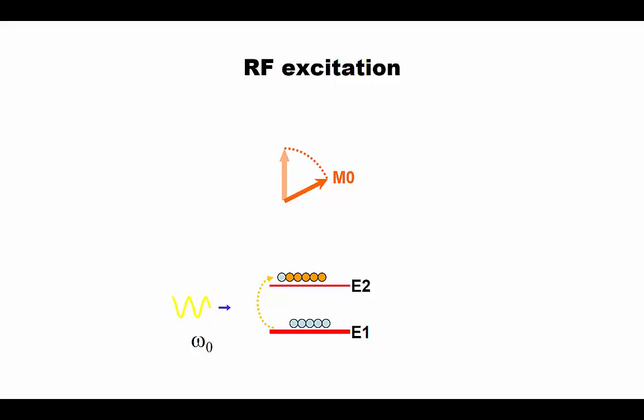When activation is stopped, each component will come back to the original position through the so-called relaxation process. During this relaxation process, it is possible to isolate the Z component from the XY component. The Z component change we call T1 relaxation, and the XY component change is T2 relaxation. It may be easier to see a movie clip to understand this excitation and relaxation process.